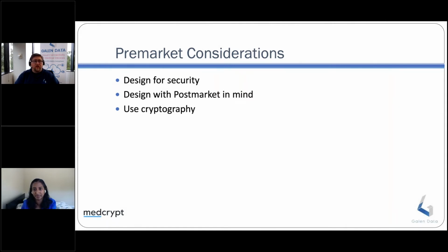So even though technology is evolving very rapidly, IT is no different than any other industry where change actually happens very slowly because of cost, because you want to make sure you don't have interrupted service or anything like that. So depending on that hospital's IT department to keep all your stuff secure as well, that can be very problematic.